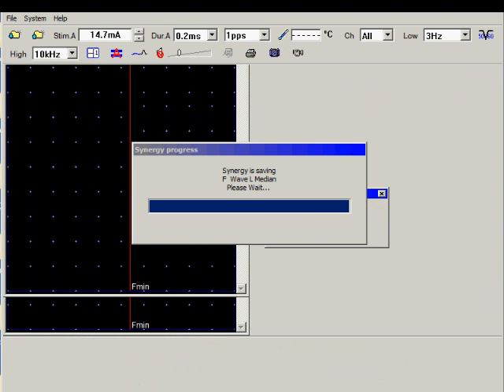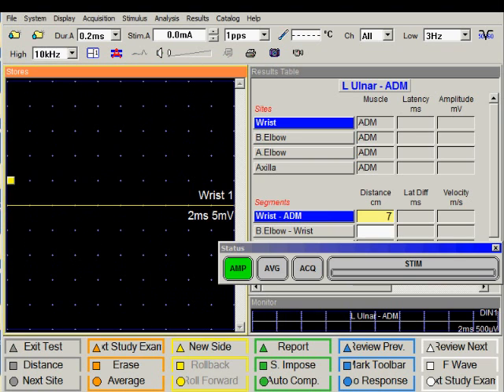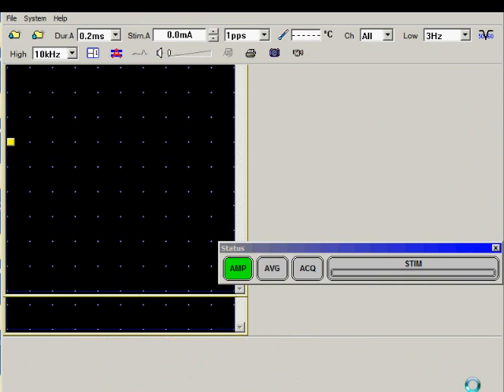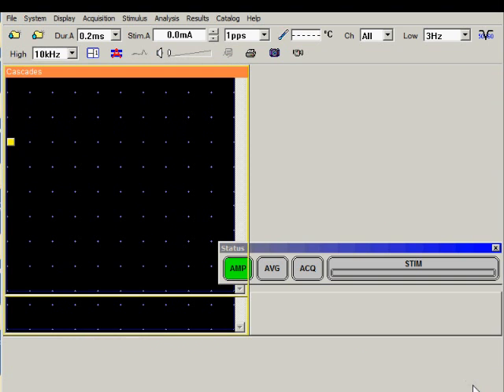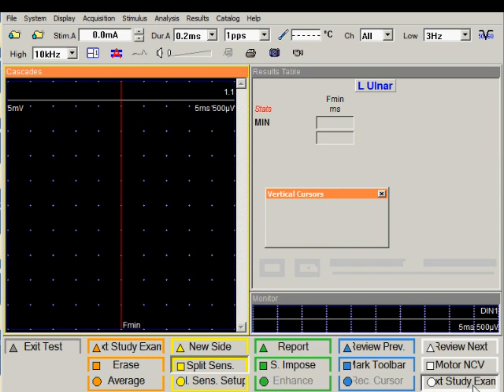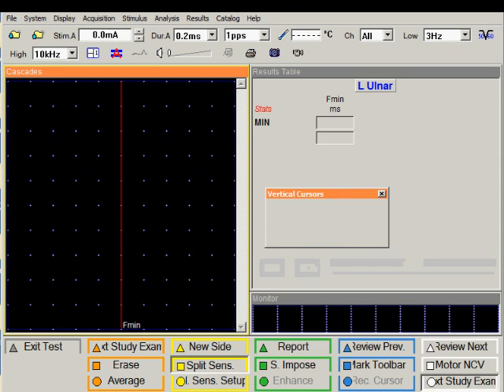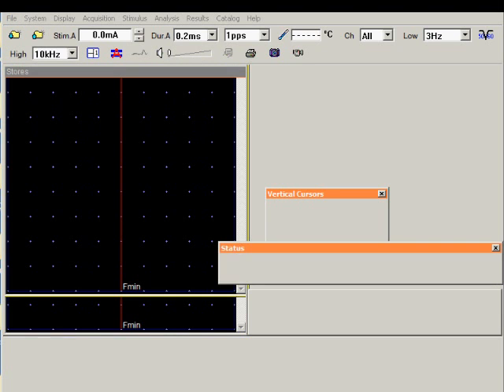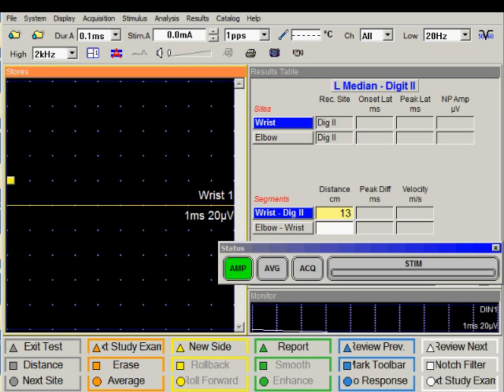And this is going to select the ulnar motor nerve conduction study. If I don't wish to perform the ulnar nerve conduction study, I can skip it very easily by once again clicking on the next study exam. And I will skip the ulnar F wave. And I can perform the median sensory exam which was part of this study group.